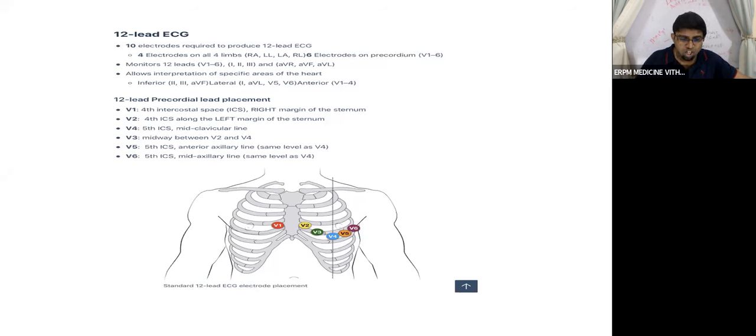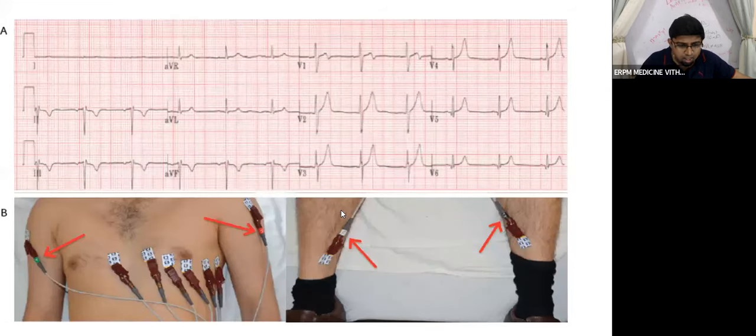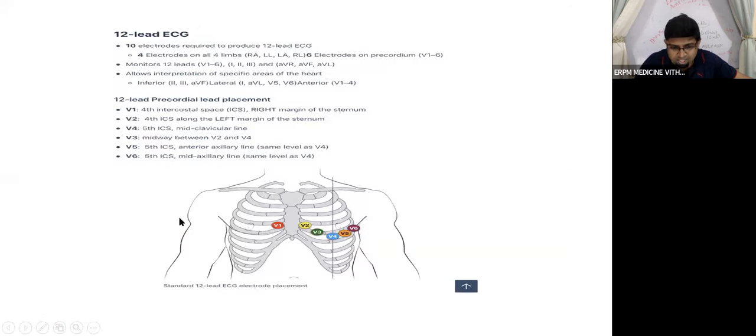I'll come to the additional points from now onwards. Look here. Now, how do you put these leads, guys? Just have some idea. You have seen these photos, right? You have seen the technician doing this. Your ECG technician will come and paste this. So where does he put them?